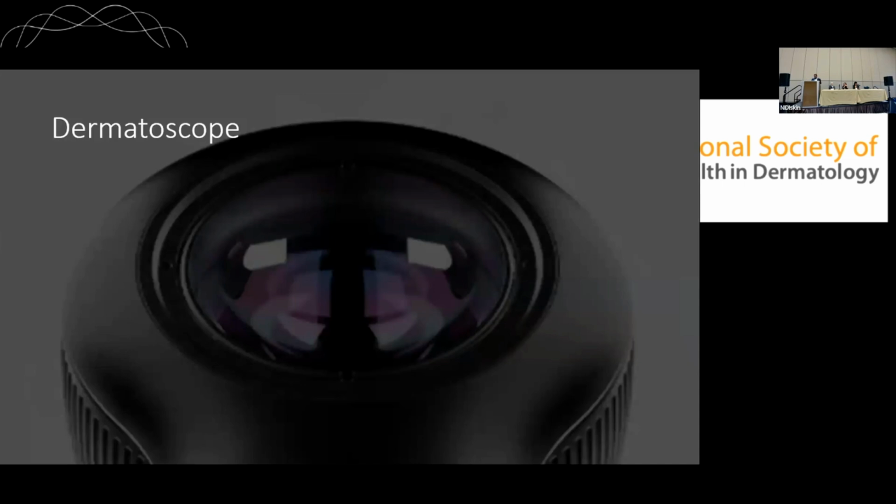So in the dermatoscope world, it's changed. Previously we just had the keyhole dermatoscope, then you could use only non-polarized models. I think a lot of you did train on non-polarized models. And then came the polarized models, then there were the hybrids. On the hybrids, there is a new addition.